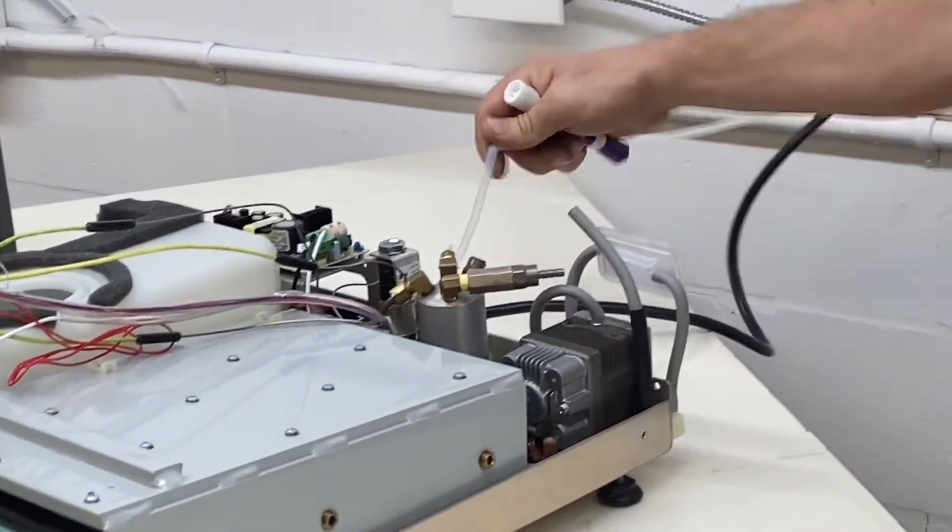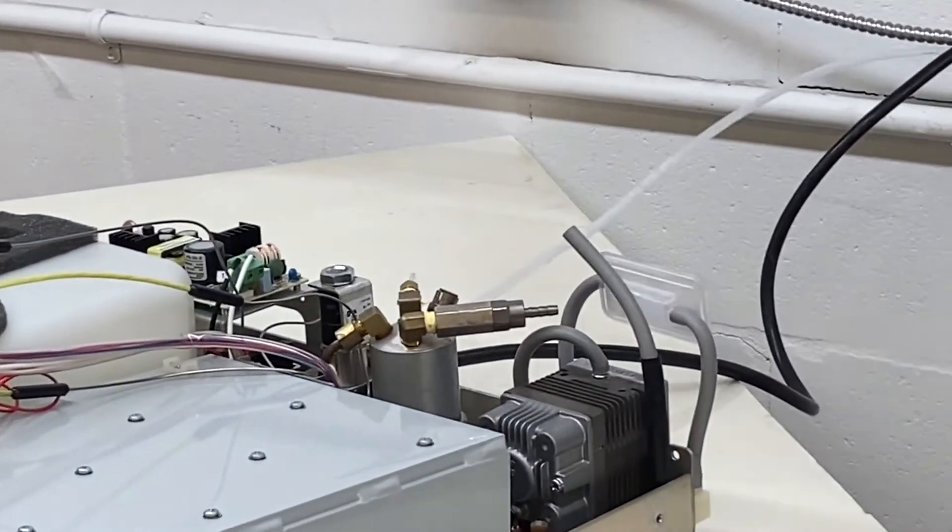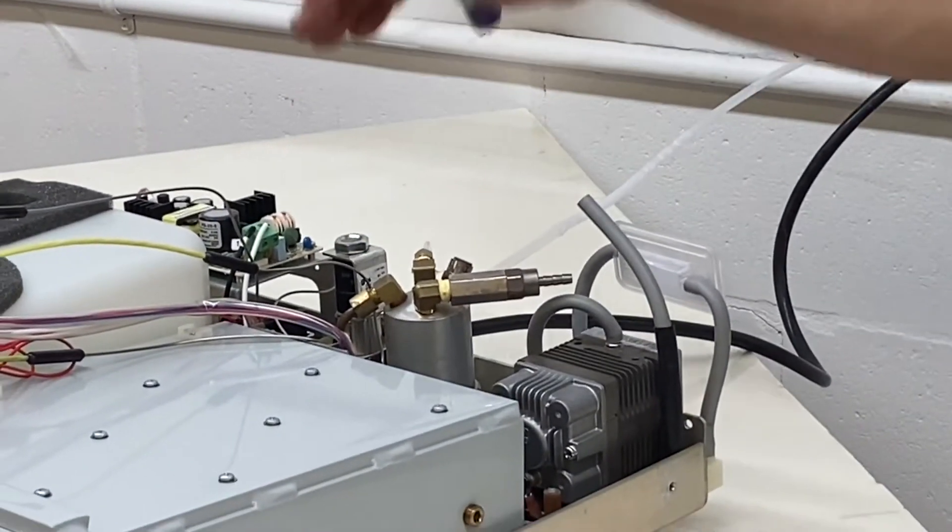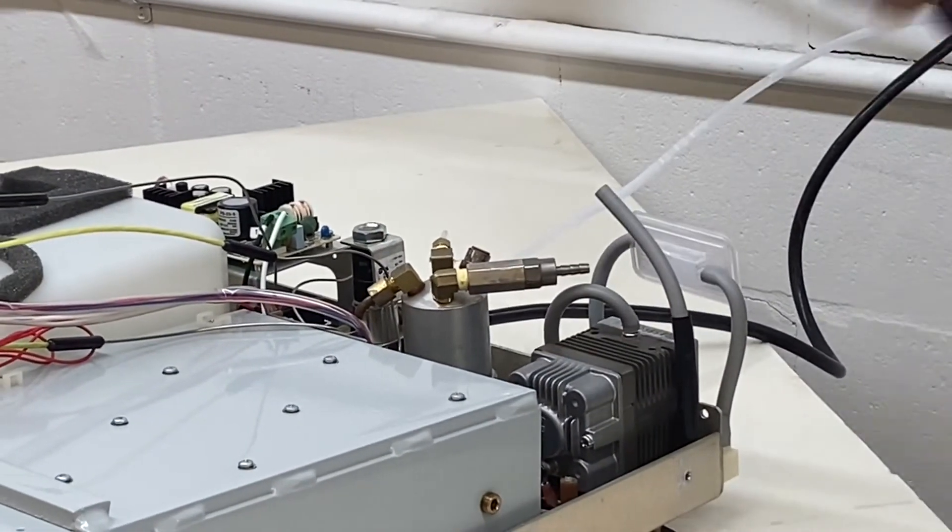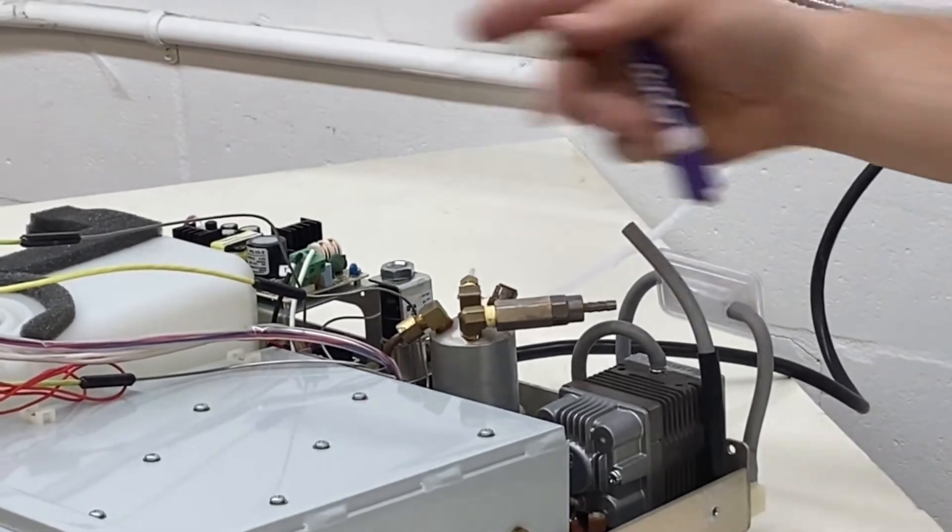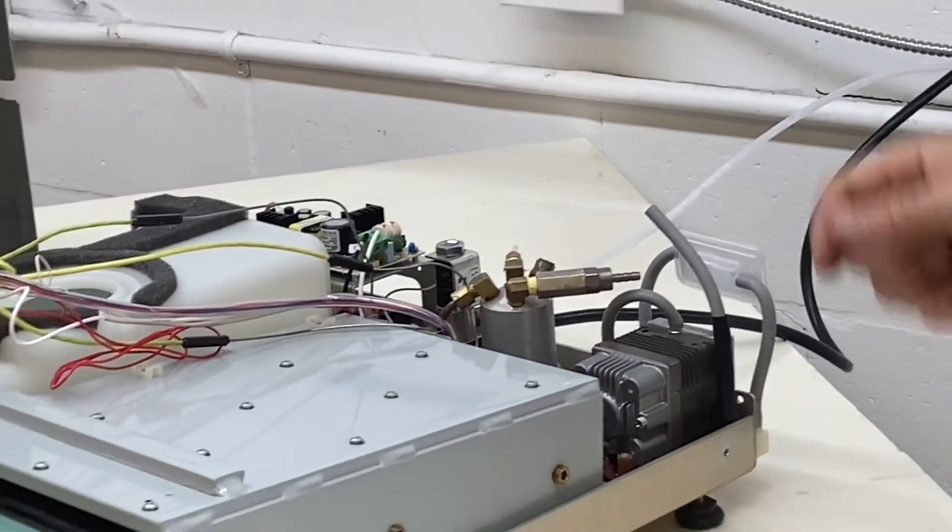If it's kinked or pinched and the solenoid opens, it can't exhaust, therefore it'll throw an error.